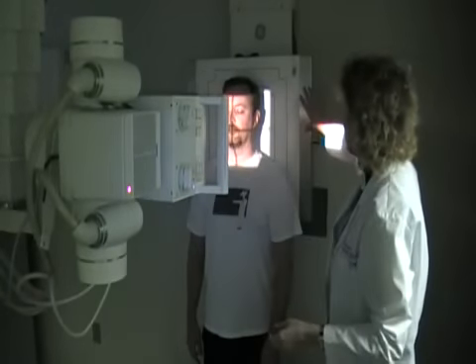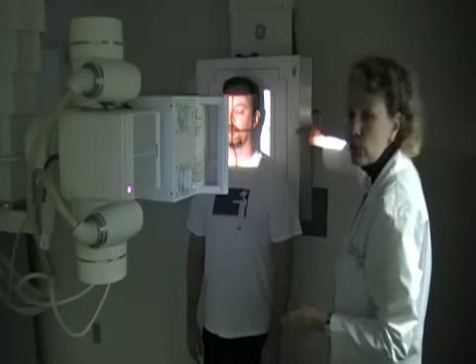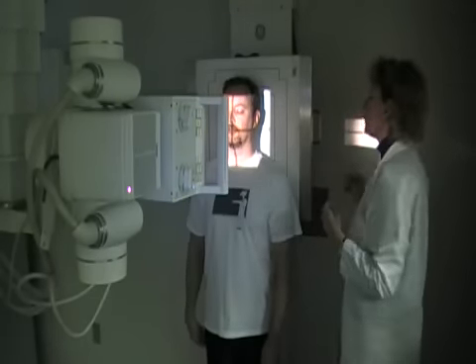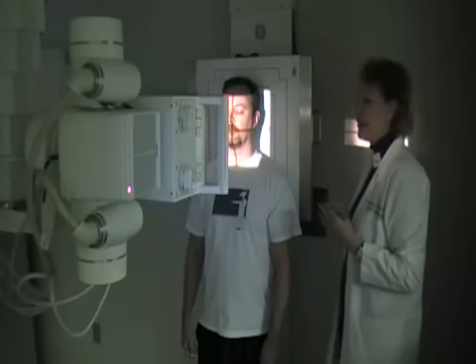Double check, make sure your bucky is at the correct height. Then I can see where this central line is intersecting with the center of the bucky tray. Now, once I have it set up at this point, what we want to be real careful about checking is that occlusal line.